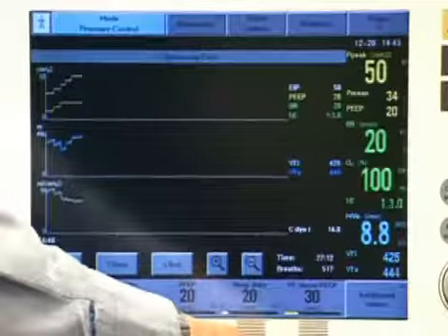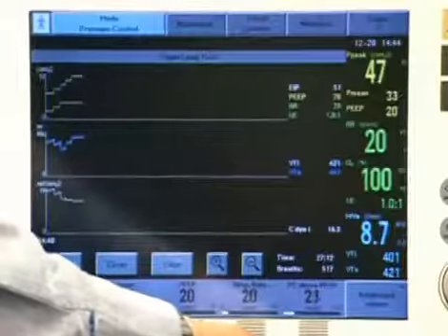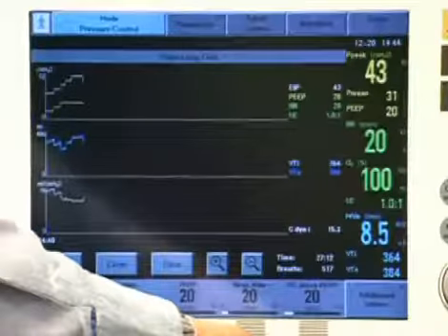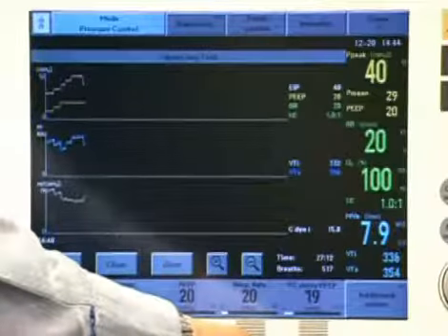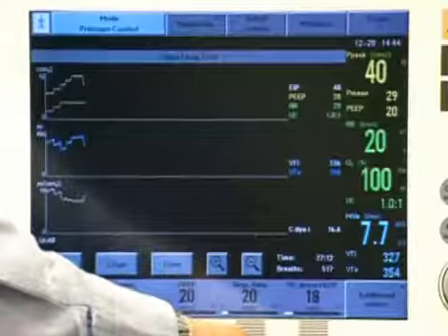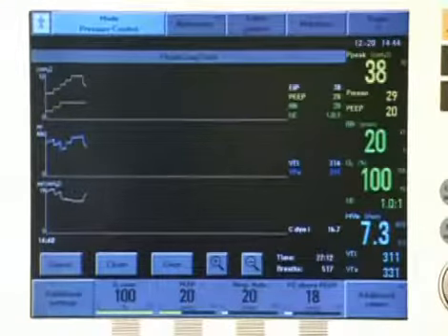After completing a recruitment time of 2 minutes, the pressure gradient is reduced to obtain pre-recruitment tidal volumes by decreasing the plateau pressure and maintaining the PEEP level. The immediate effect is an increase in compliance, in this case returning initially to pre-recruitment values.